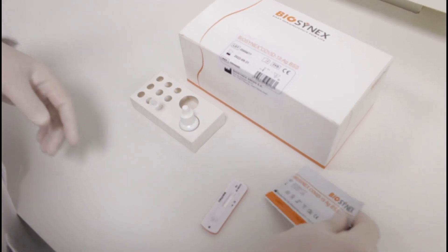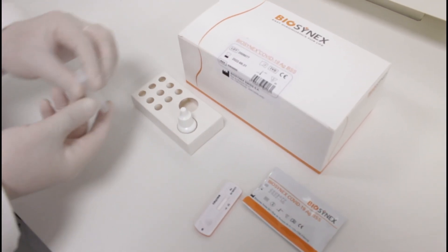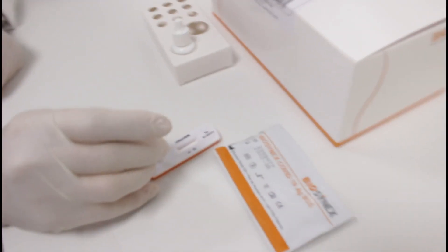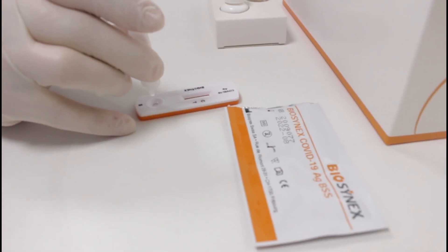Remove the test cassette from its pouch and place it on a flat and clean surface. Take the extracted sample and place 4 drops into the S-well on the test cassette.